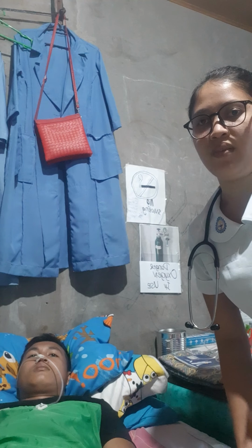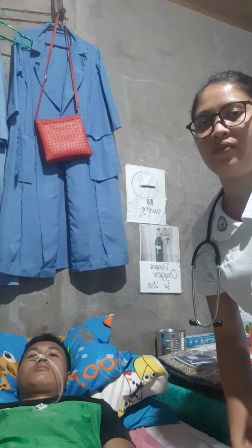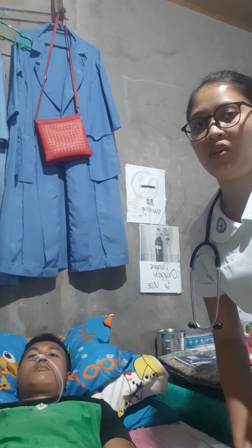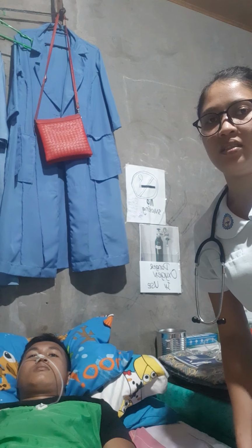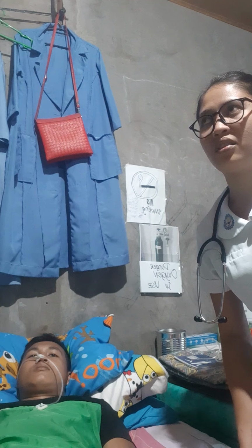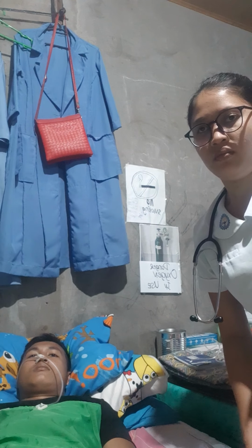Then, check for the presence of bowel sounds, if there is, and if there are problems that suggest lack of tolerance of previous feedings, such as delayed gastric emptying, abdominal distension, diarrhea, cramping, or constipation.